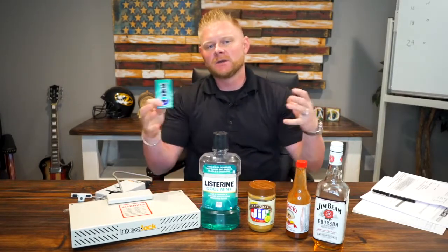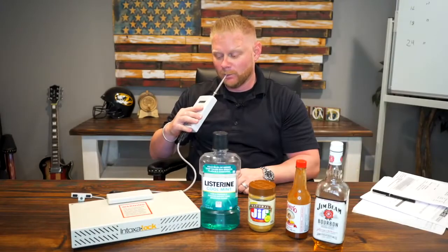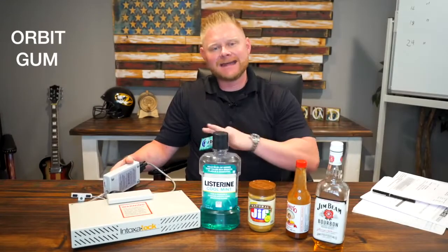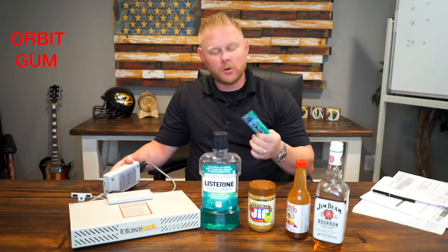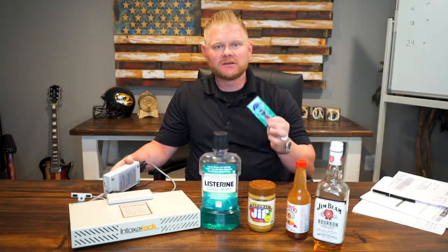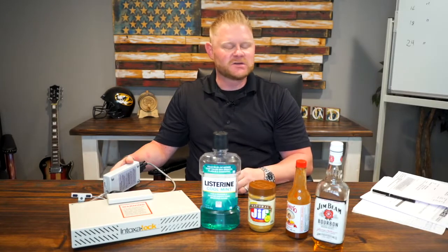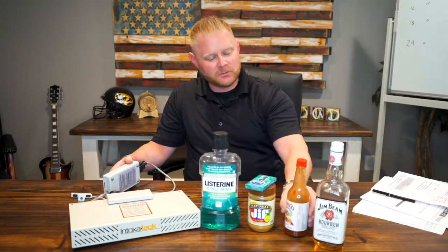The third one is wintergreen gum. The result: Orbit gum had no effect on the blood alcohol content. This wintergreen gum was supposedly supposed to alter what your test shows, and it did absolutely nothing.